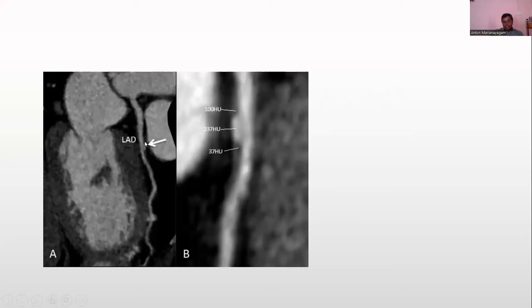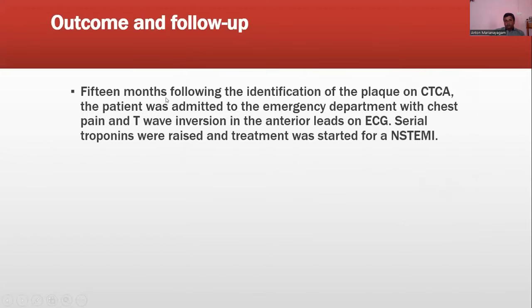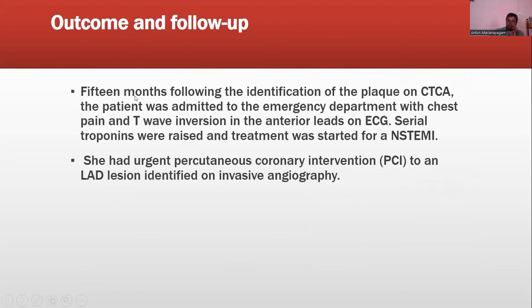What you see is an abnormality in the left anterior descending. Now, you cannot pick one vessel disease in this particular reconstruction. These are labeled by the computer, and because we do the reconstructions, the one who is doing the reconstruction knows what vessel it is, so don't worry about it. This is a peculiar type of plaque. It is not a dark plaque with fat or a plaque with calcification. This characteristic indicates vulnerability of that plaque, even though the luminal narrowing was minimal.